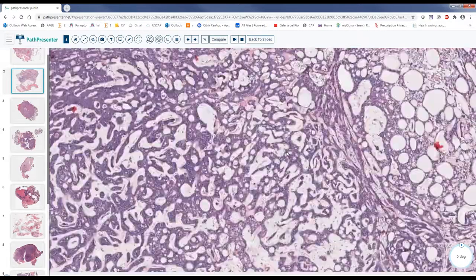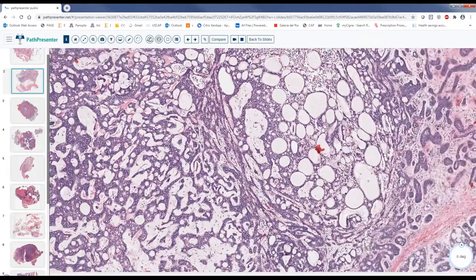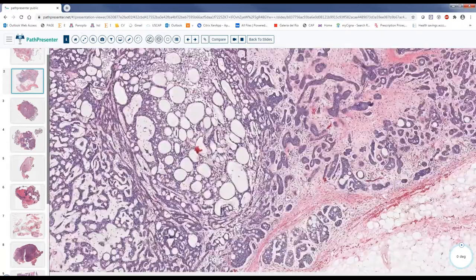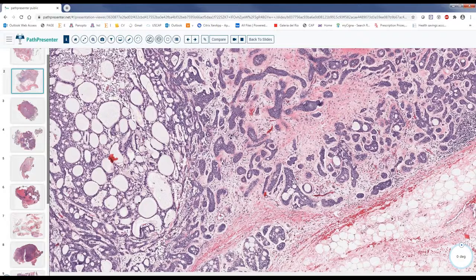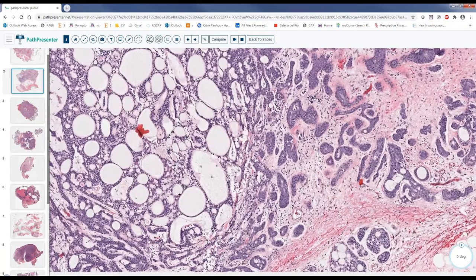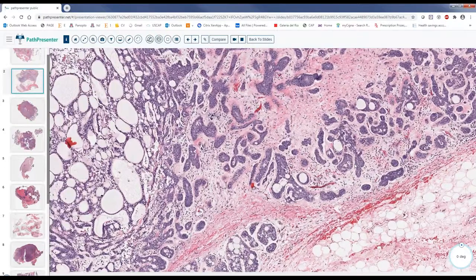Okay, while discussing it, again, it is from the name. Does anybody know why we don't say adenocarcinoma, we say adenoid? Is there any reason? What is the difference? Excellent. These lumens that we see here are not really ducts of adenocarcinoma or acini. They are just pseudolumens, not real lumens. There won't be any real secretion into them. And actually, they hold a lot of basal layers that are P63 positive.